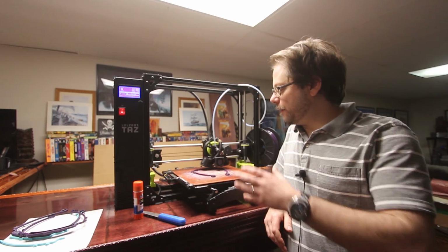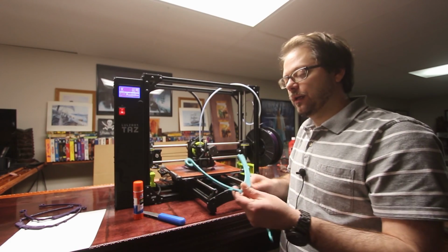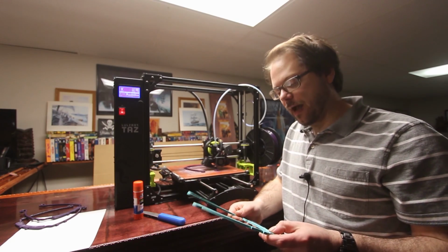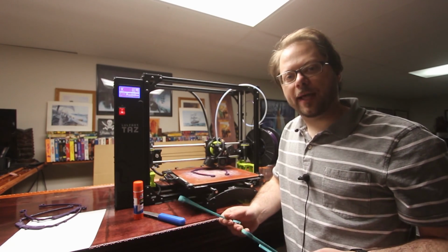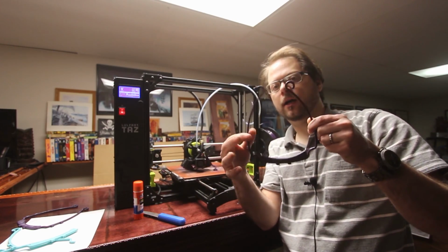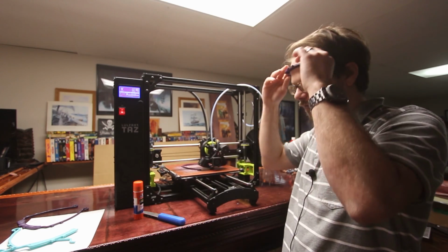Okay, so we're starting to get some of our visors off the 3D printer now, and just like I expected, the visor that was printed in PLA broke before I could even take it off of the build plate. I knew going into it, I was really worried that the PLA filament wasn't going to have the flex that we needed, but if you look at the ABS visors, there's actually a great deal of flex and give to these. So we're definitely only going to be 3D printing in ABS from now on for our visors.